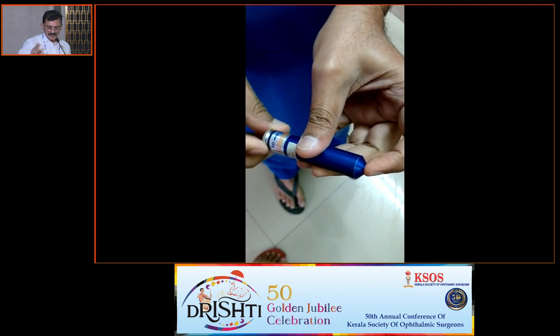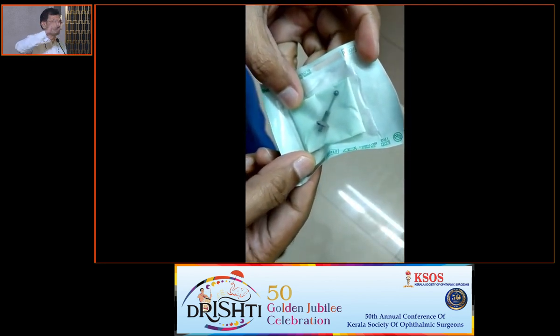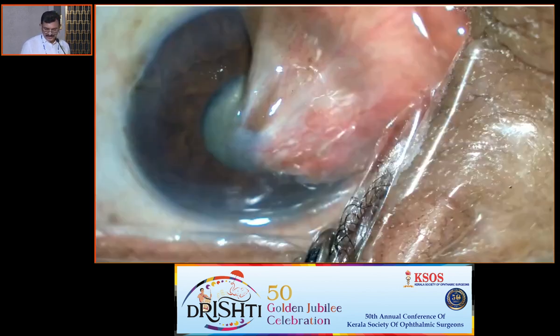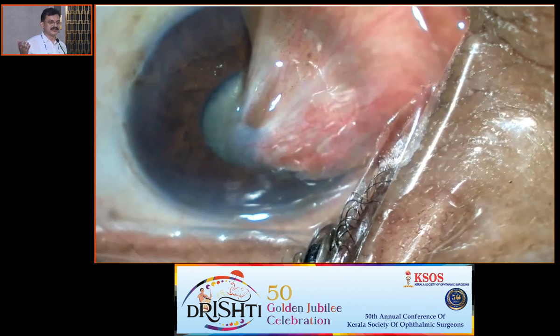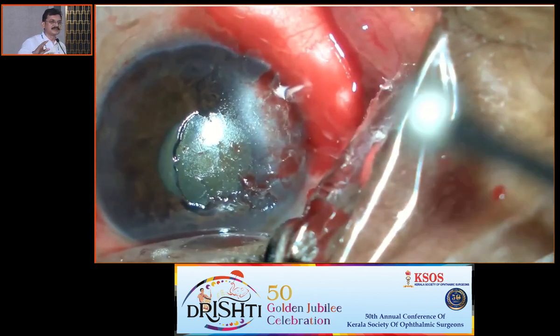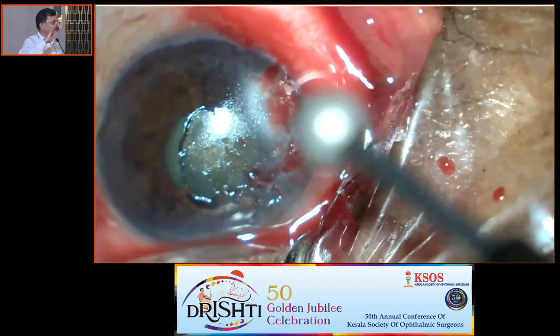So when you turn it fully, it will rotate. When you unscrew it a little bit, it will stop rotating. That's the contact time. So this is a pterygium. You see that it is coming to the pupil area, and you try to cut with the blade. It's gone.